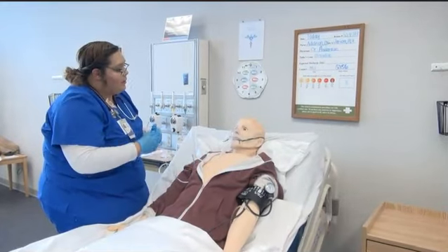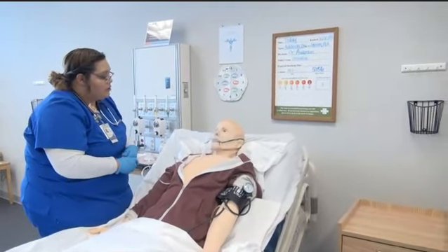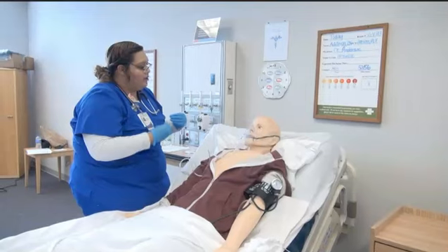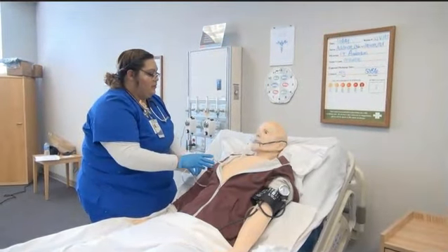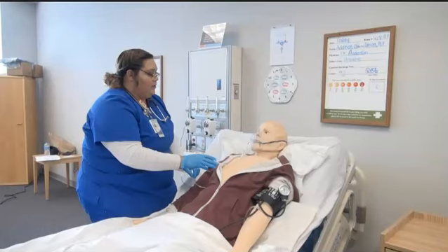Now every fifth breath, I want you to do the same motion, okay? Take a deep breath in, hold it for 10 seconds, and breathe out. Notice the respiratory therapist continues to coach the patient on what needs to be done. During this time, she is also monitoring the patient and looking at the patient and their monitors.